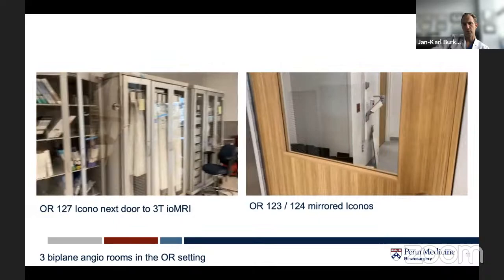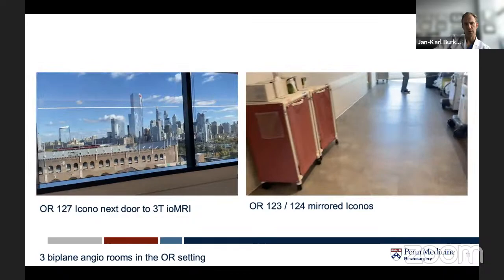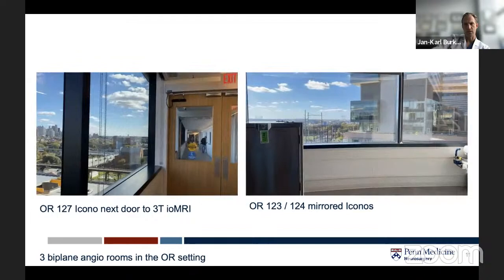These rooms on the right side we mainly use for endovascular procedures, but they're all completely equipped so that we can always switch to an open procedure as needed. And 127 is mainly for our open cases, or if you don't have an open case scheduled, this is also an overflow for strokes or for endovascular procedures.